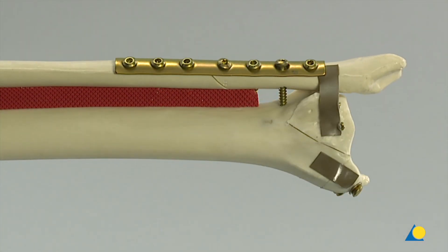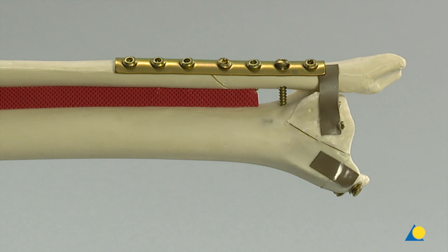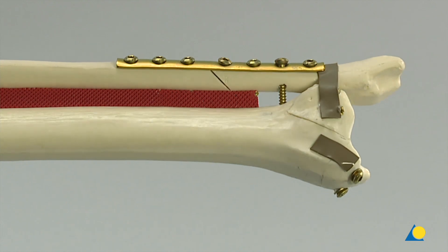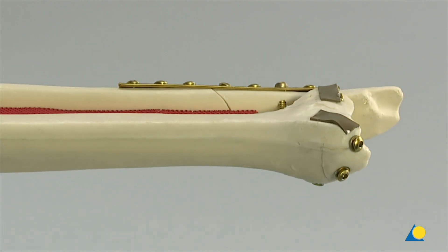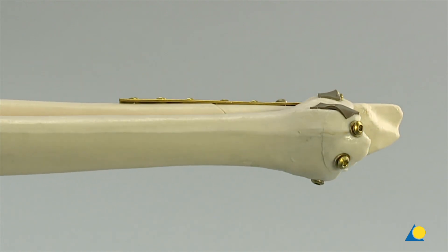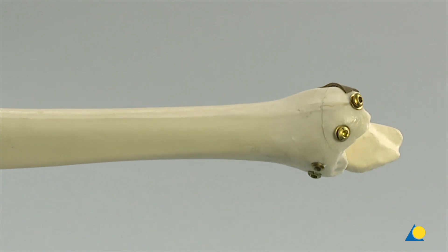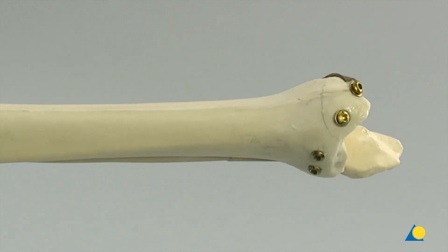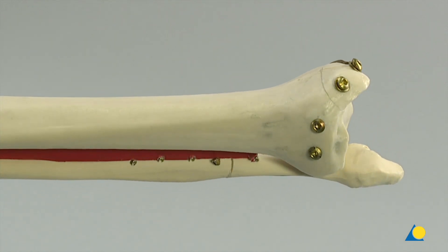Here we can see the positioning screw parallel to the joint, the lag screw fixation at the medial maleolus, and the posterior maleolus fragment with screws inserted from anterior.